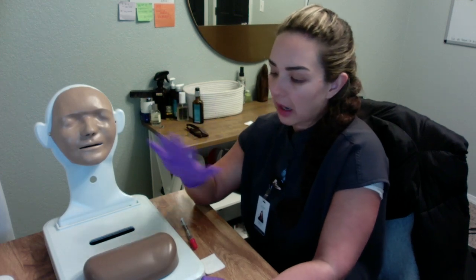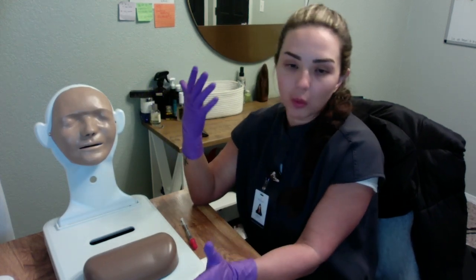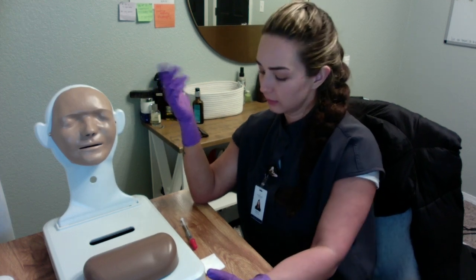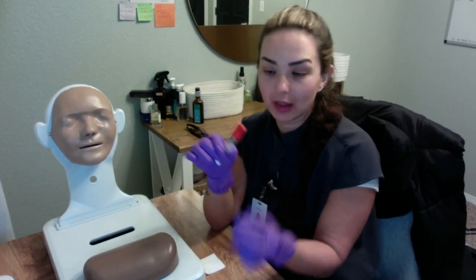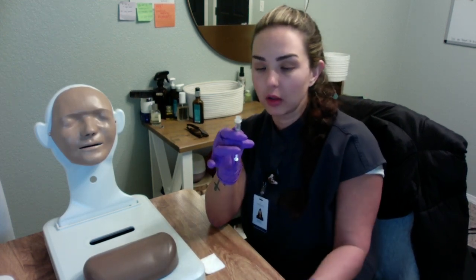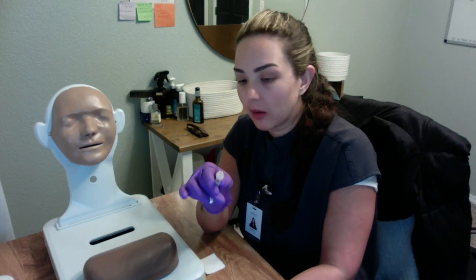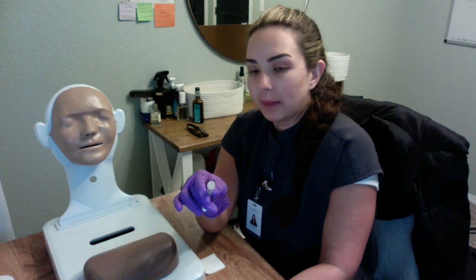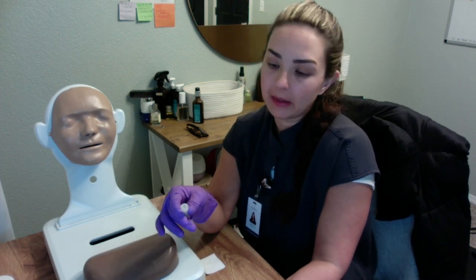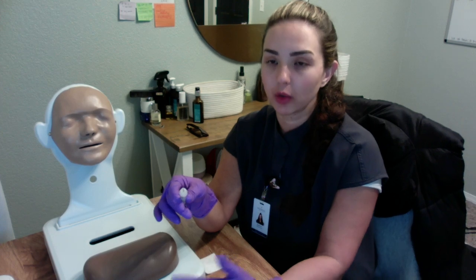Okay, so now that we have identified the site, we're going to go ahead and perform the injection. So with this, we want to make sure that we're holding it like a pencil, kind of. Again, thumb and pointer finger. We want to make sure that we are administering it bevel up. Now, if we don't do it bevel up, we will not be able to create our bleb, and that's what we need in order to get that response, right?